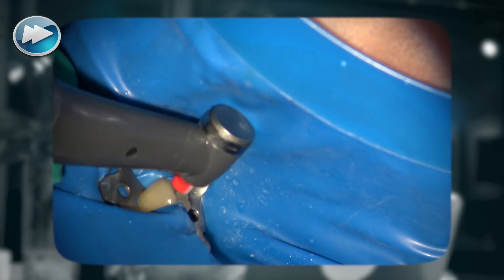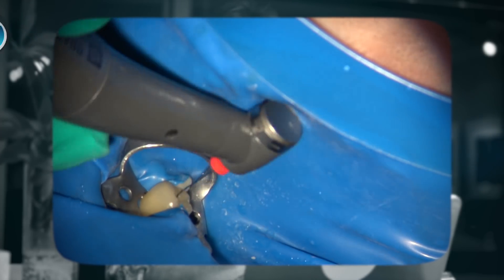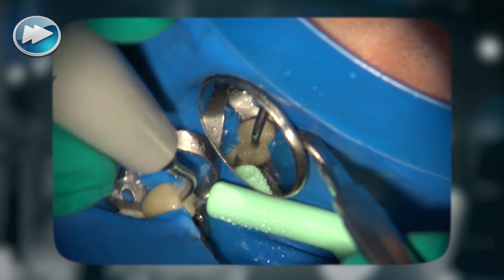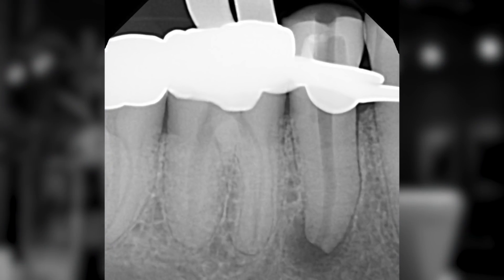So 20 seconds with hypochlorite, irrigate out and add EDTA, 20 more seconds, irrigate out and 20 more seconds with hypochlorite — and at this point most of the time you are done. You can do your final irrigation, and at this point, as you can see, a radiograph was exposed to make sure that all the gutta-percha and debris has been removed, and you can see a very clean canal.